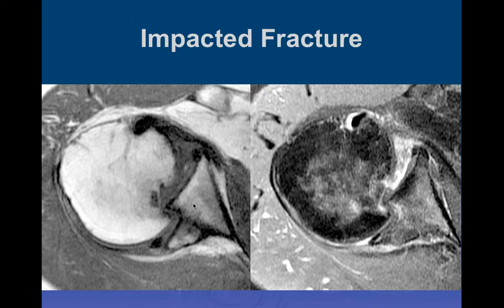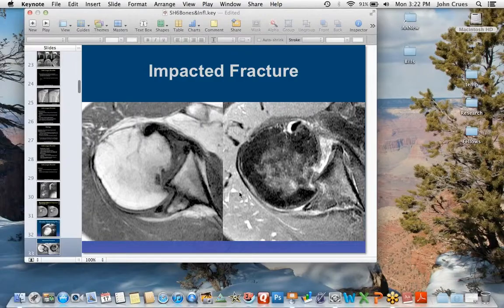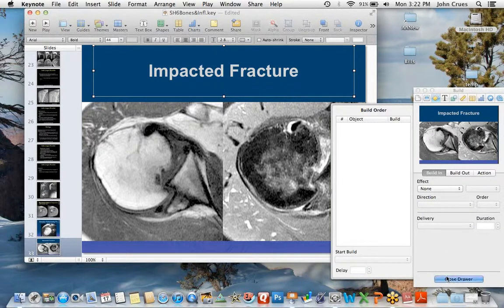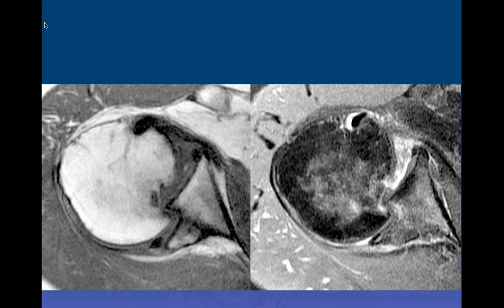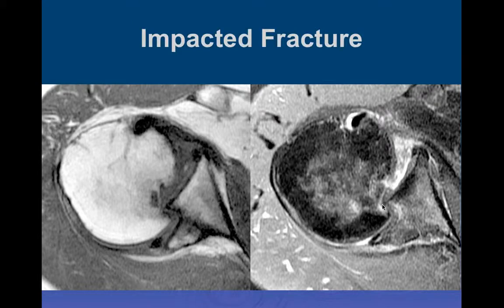On two axial views of the shoulder, there appears to be a posterior dislocation with a locked impaction fracture — the anterior humeral head impacting on the posterior corner of the glenoid, which is a reverse Hill-Sachs injury. This is an impaction fracture of the posterior glenoid with a concurrent reverse Hill-Sachs impaction, rather than a complete dislocation — essentially fracturing both bones simultaneously.